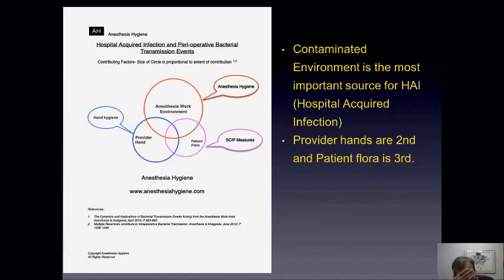Yes. But basically, what I was trying to say was all these studies were done with institutions cleaning their machines and educating the technicians to clean the machine. Of that, these studies documented all these findings. So the SHEA guidelines were prompted mainly because they noticed that the current protocols are not enough and we have to do more. That's why the SHEA guidelines have been published, and they've been supported by all the societies.